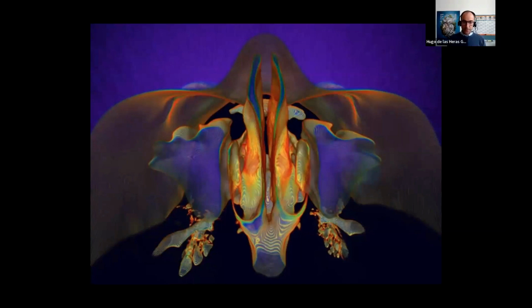When you see it, you don't really know what it is, but it is a tomography of a nose, and it actually won a contest of images in science from the journal Science. This is definitely not what we want to do in diagnostic radiology. We don't need pieces of art. We need something that is appropriate for the clinical indication.